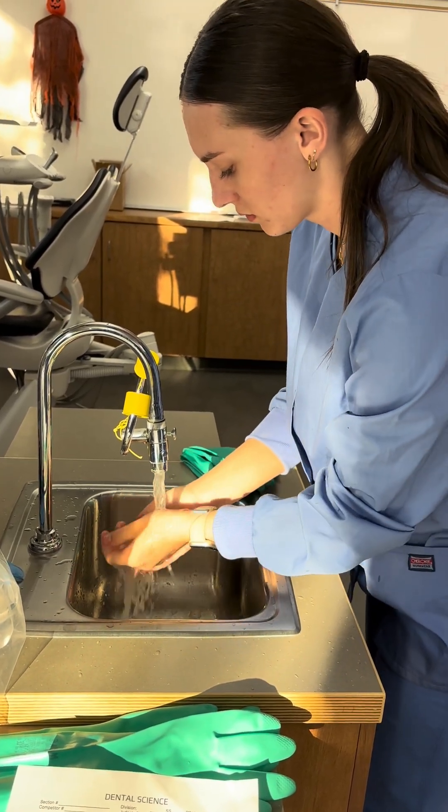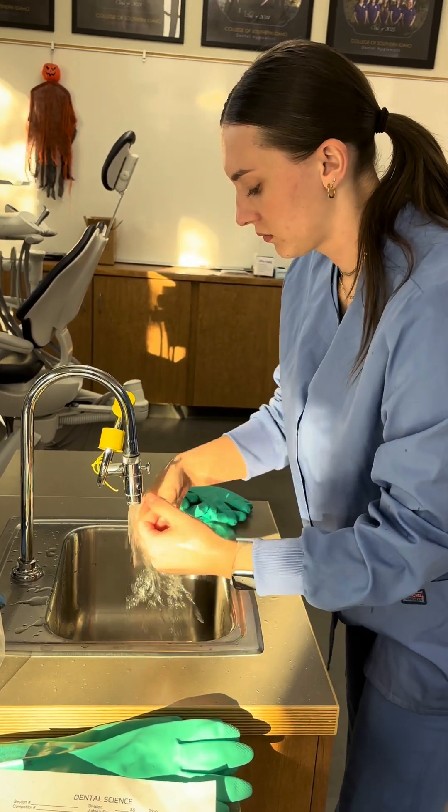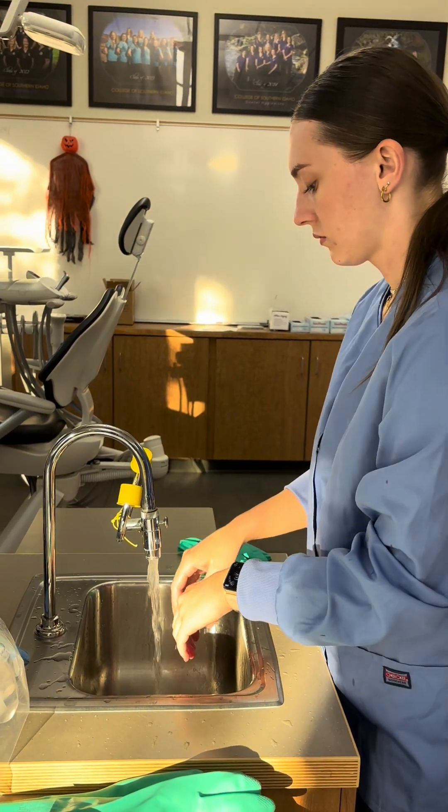Nails, cleaning everything that it touched. And she's going to dry them.